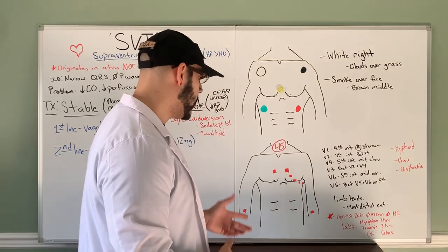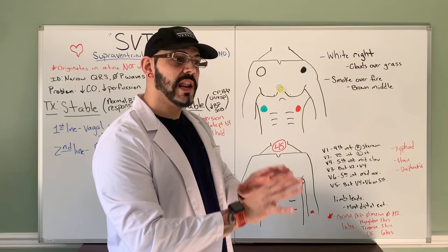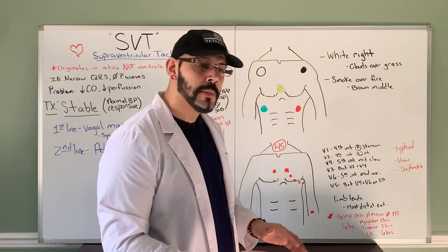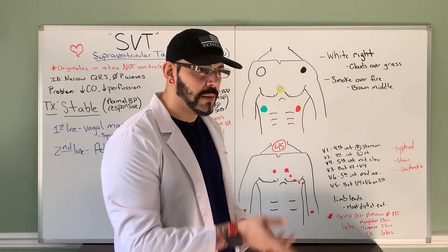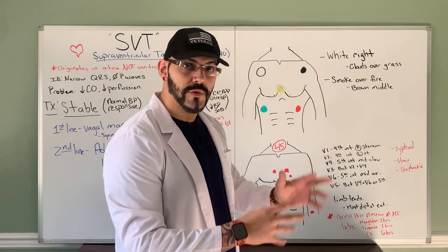So let your patient know, hey, listen, I'm about to start this diagnostic test real quick. I need you just to relax, don't move just for a few seconds so I can get a proper reading. And then once everything is lined up properly, you hit that rhythm strip, get your proper rhythm, get the information you need, upload it into the system so the provider can see it, and you're good to go. They can move all they want, all right?